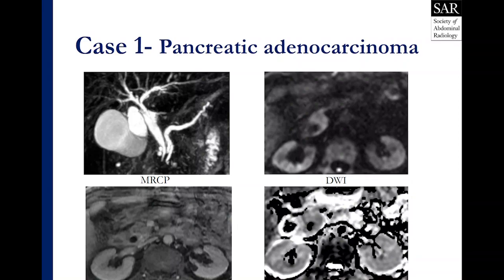Here are a number of example MRI images. The MRCP image in the top left shows the double duct sign — you've got a diffusely dilated common bile duct and a diffusely dilated main pancreatic duct. On the top right, there's diffusely increased signal within the pancreatic head tumor with concurrent low signal on ADC images in the bottom right. And on the bottom left post-contrast image, there is very vague heterogeneous enhancement of the pancreatic head, but overall hypoattenuating compared to the adjacent parenchyma.